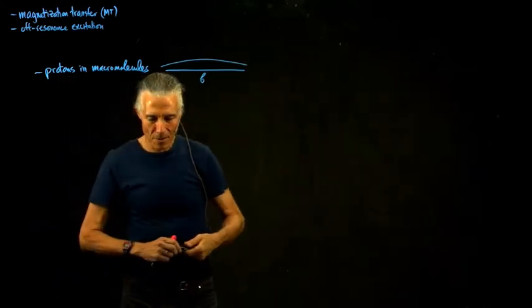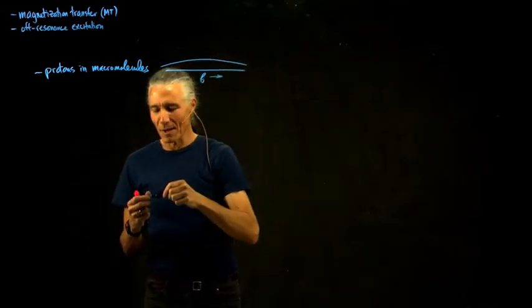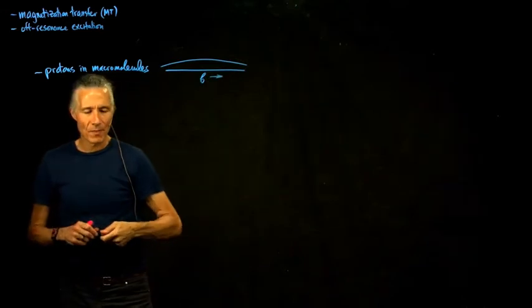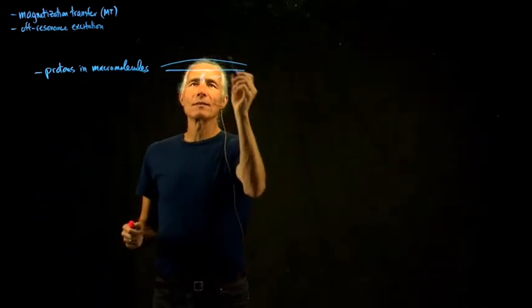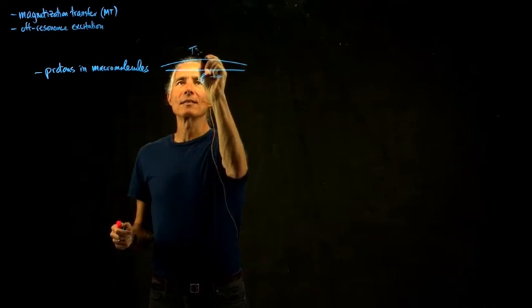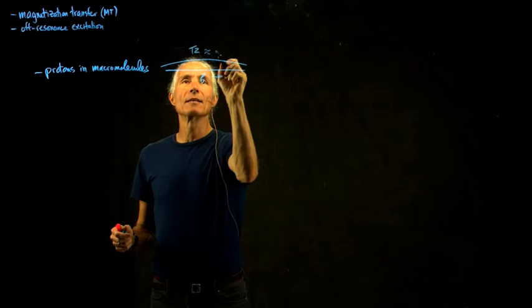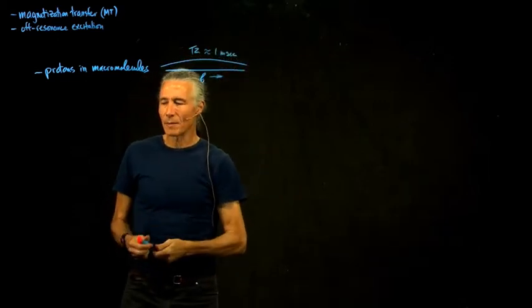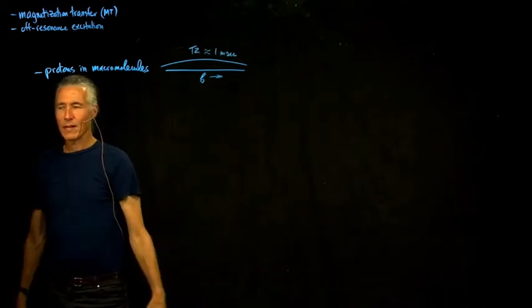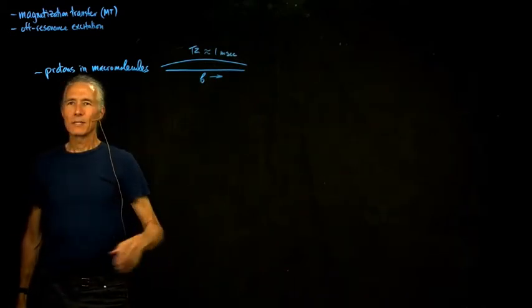So their frequency is not well tuned compared to water. But there's another way that they're different, and that's that the T2 is extremely short. The T2 of this is like 1 millisecond. The shortest echo that we typically do on the scanner is like 2 or 3 milliseconds. So pretty much these things have disappeared.